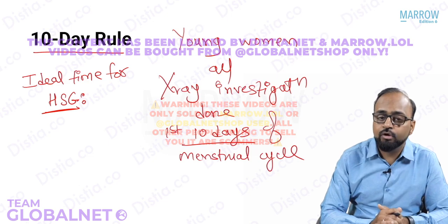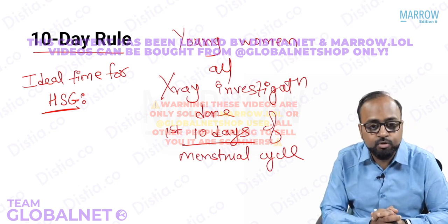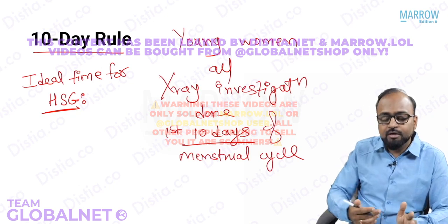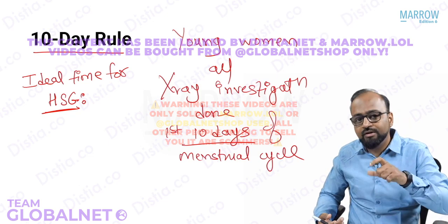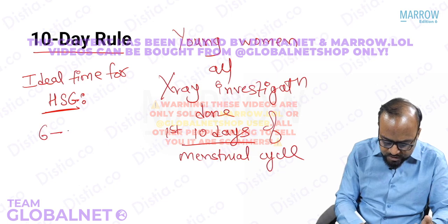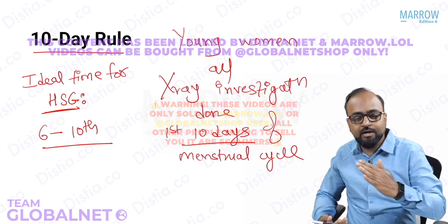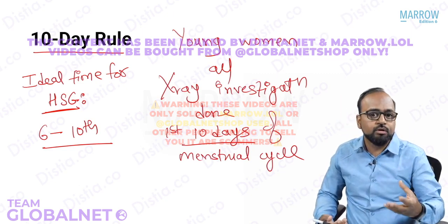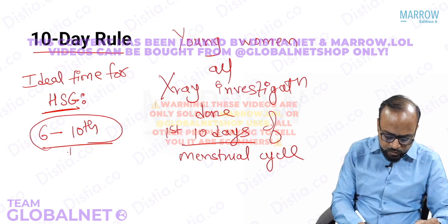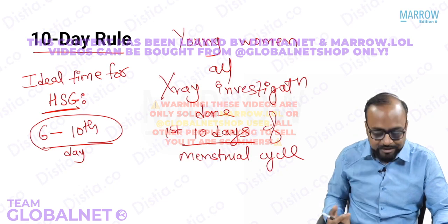HSG is done for evaluation of infertility patients, Mullerian duct anomalies such as unicornuate, bicornuate, septate uterus, and tubal patency. As an application of the 10-day rule, it has to be done in the first 10 days, but in the first 5-6 days, when menstruation is going on, we avoid injecting contrast to avoid the risk of infections. So the best time to do an HSG is usually the 6th to the 10th day, because by the 5th or 6th day the bleeding has stopped, and up to the 10th day we are sure that no conception has occurred, there is no embryo, even if it is a short cycle. This is considered the safest period to do a hysterosalpingography. So this is about the 10-day rule.